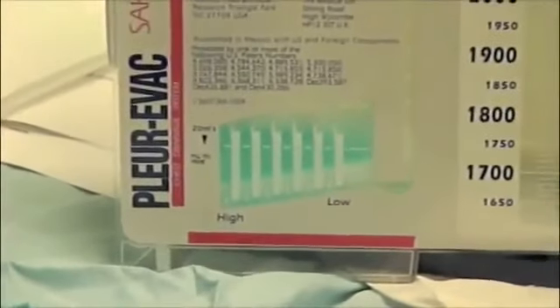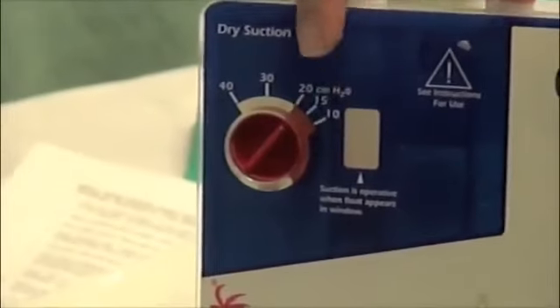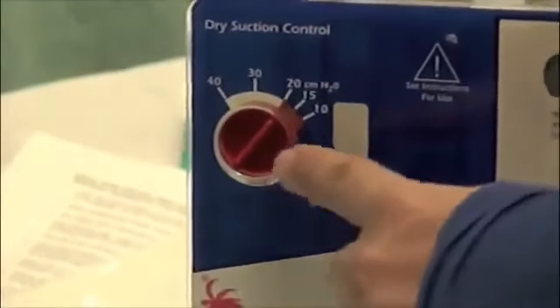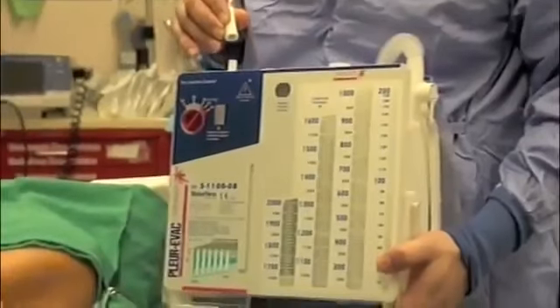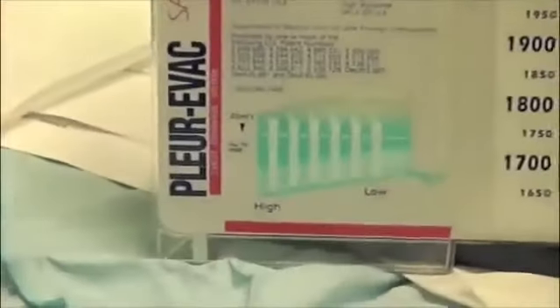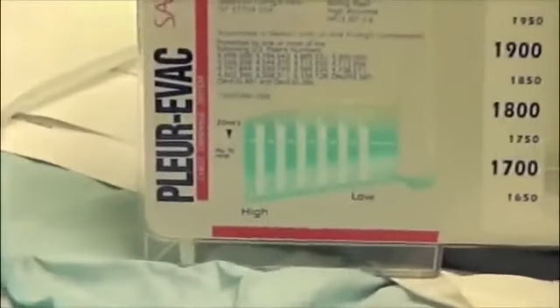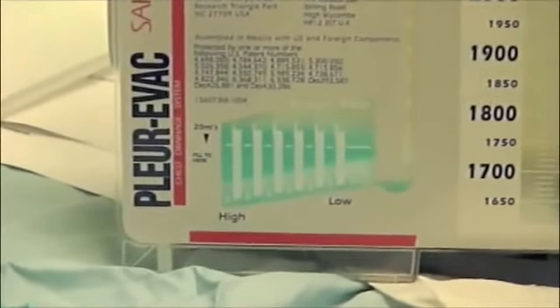Ask the patient to cough and observe for bubbles in the Pleurovac. Set the suction to -20 centimeters of water. You should observe the orange float rising once the wall suction is applied. Bubbles will appear in the air leak meter if there is an air leak or if patient coughs.